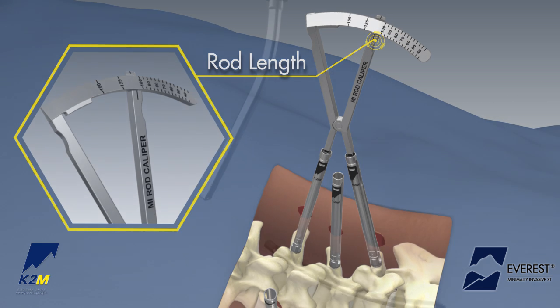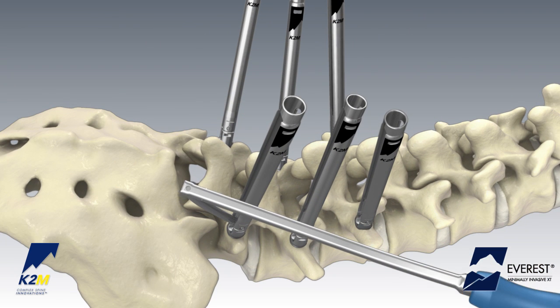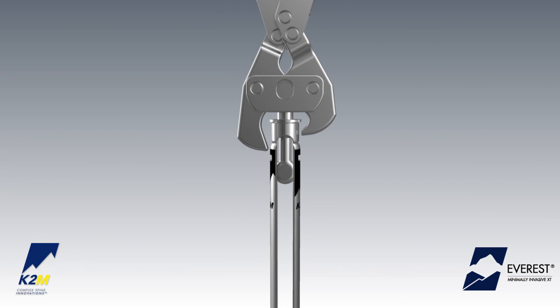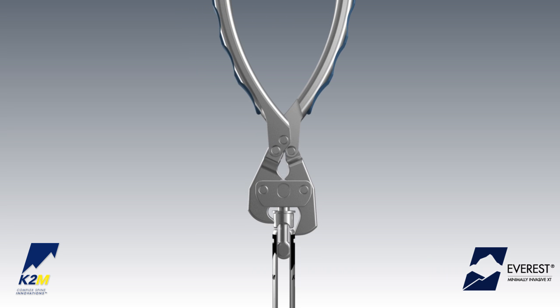Load the hex end of the rod onto the rod inserter and secure by fully tightening the dial. Insert the rod by using the tapered tip of the rod to slide through the muscle tissue from screw head to screw head. The XT screw allows the closed-top cap to be removed to facilitate open-tab rod passage if preferred.